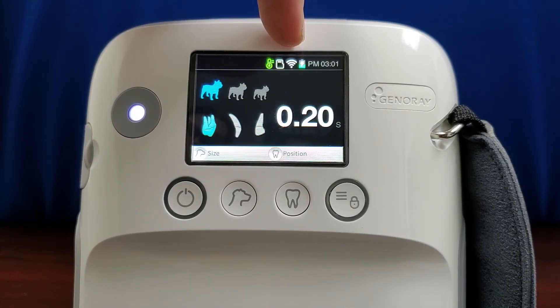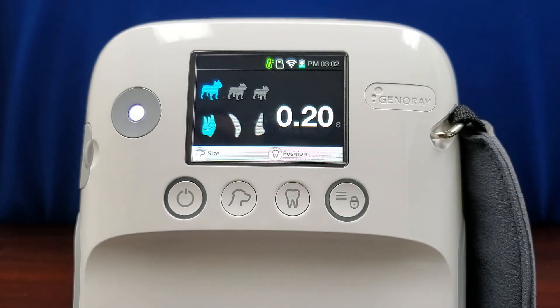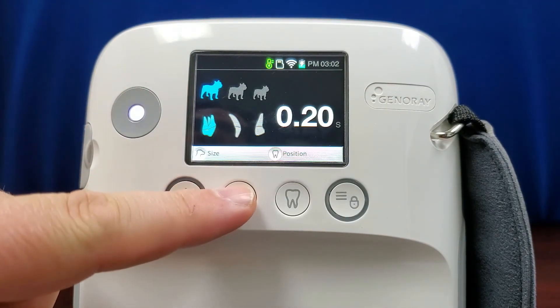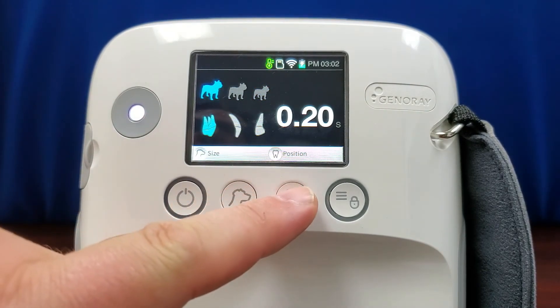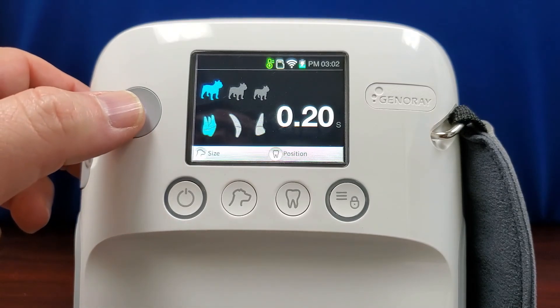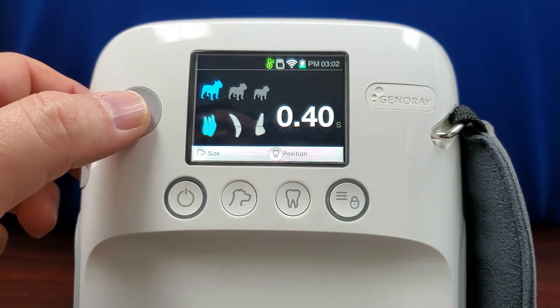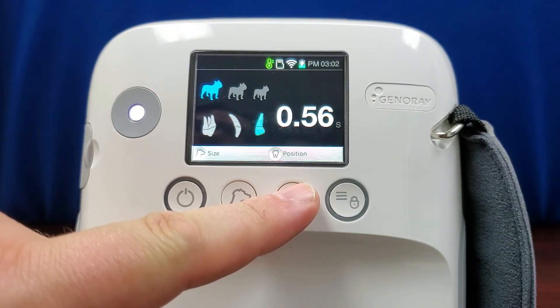The next icon indicates if the unit is connected to a Wi-Fi signal. The next icon indicates battery level, and the final display is the current time. Below this, the size of the animal is shown and can be changed by pressing the size button. The tooth position is shown below that and can also be changed by pressing the position button. Changing either of these settings will change the default exposure length, but this can also be changed manually by rolling the trackball up or down. Each time the size or position is changed, the exposure time will be restored to the default.